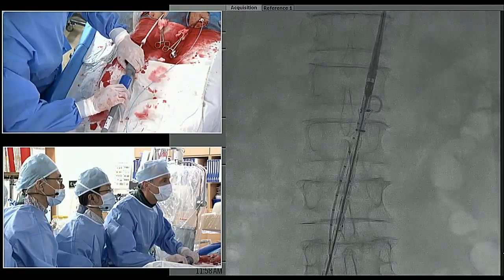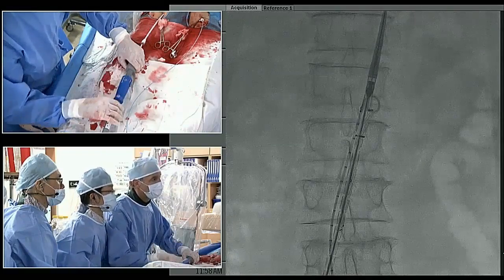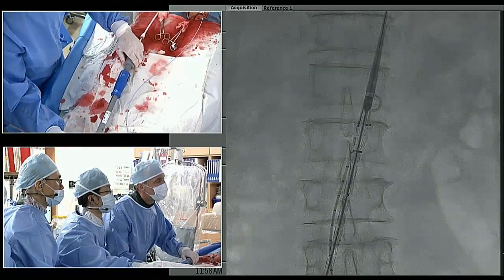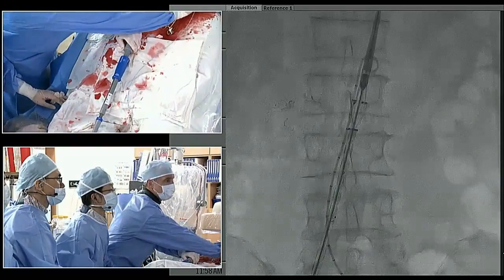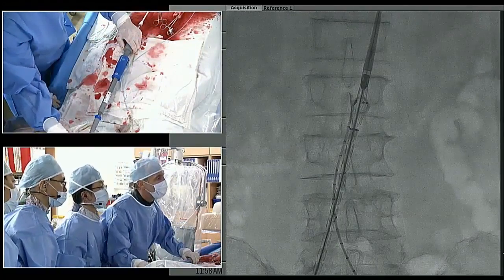So with the reverse conical shape, do the panels tend to oversize the stent graft a little bit, especially with angulation? Yeah, he's sizing it more to the lower end of it on the reverse taper. There you go. Okay. So, Bill, I'm pretty much liking that right there.